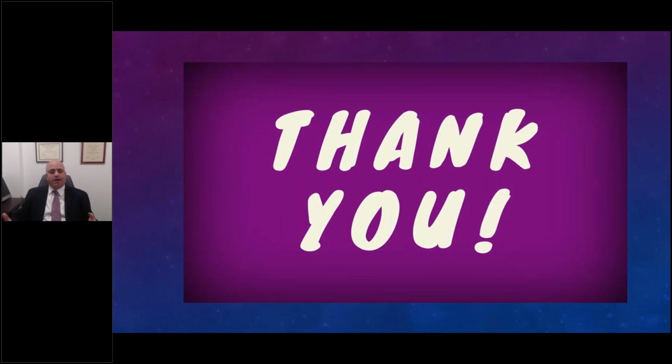Certainly, you want to calibrate your furnace prior to using the Transitions zirconia, because you want to hit the ground with huge success. But in reality, it's not specific to a zirconia. I encourage everybody on this webinar to calibrate their furnaces, because you want to make sure that your temperature is true to what the window is showing. There are some sintering ovens that have calibration components, but this proved sometimes some degrees off.